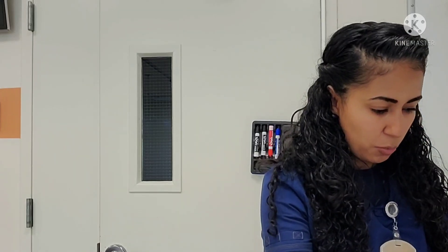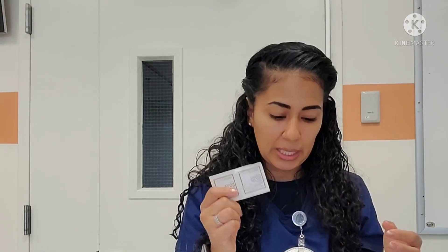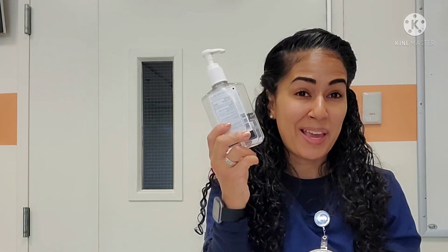Of course, we always need our antiseptic swabs whenever we're going to withdraw from a vial or an ampule — we're going to want to clean the ampule. We need some hand sanitizer and some regular clean gloves. Now withdrawing medication, you don't typically need gloves, but with an ampule, just me personally, I feel safer wearing gloves because I feel like it's an added protection against the glass. So you follow your facility policy on whether or not gloving is appropriate.